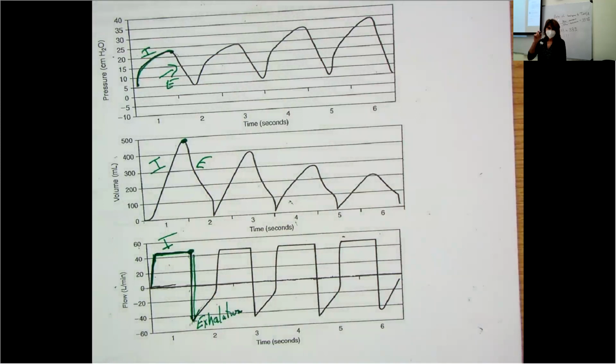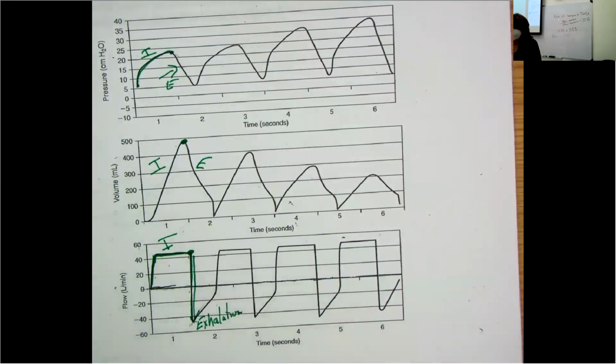All right, so that straight line going down, again, it's all one point in time. That's when the exhalation valve on the ventilator opens up and then the air can leave the lungs. So it switches from the air going in to the air coming back out. Does all the air come back out? Does this hit baseline by the time the next breath begins?